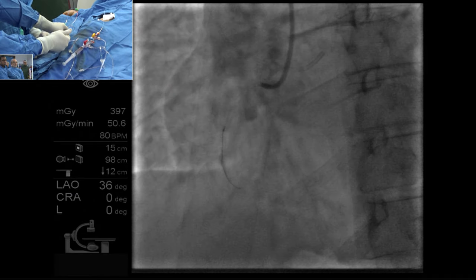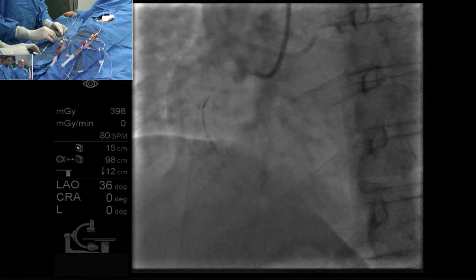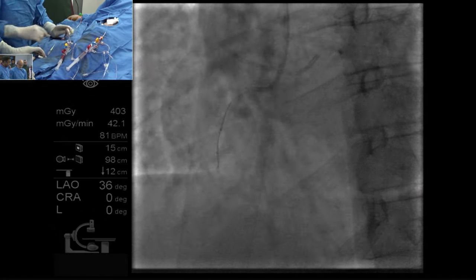So this is a Fine Cross, right? Yes. Yeah, let's go in. Yes, Fine Cross. No, it's not moving in. Wait.